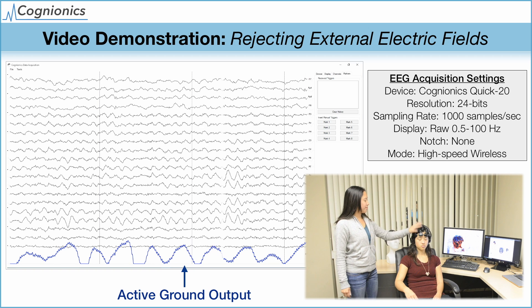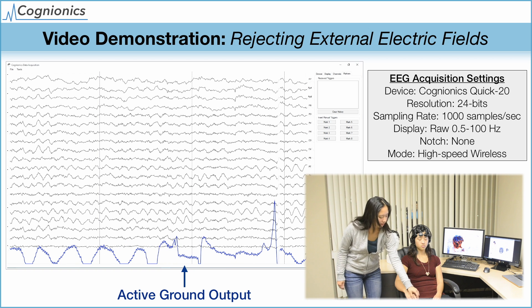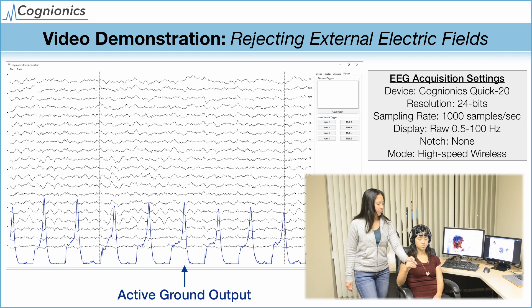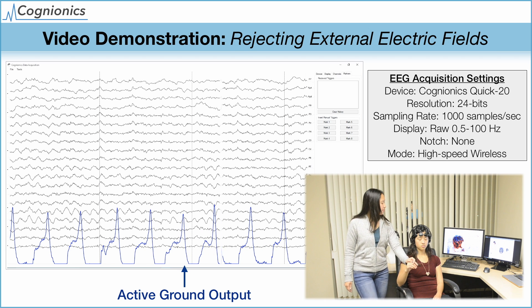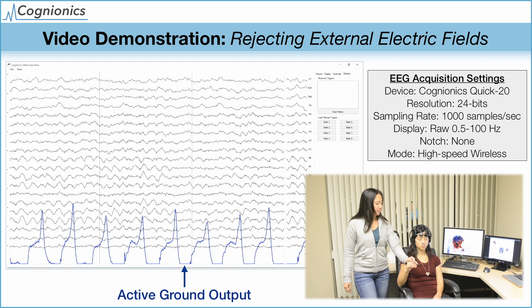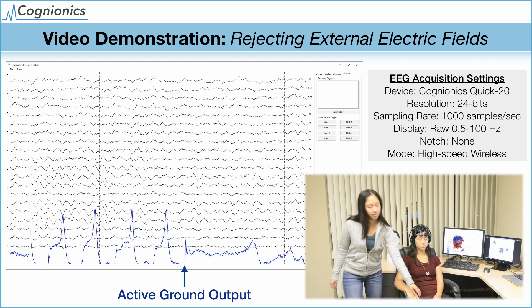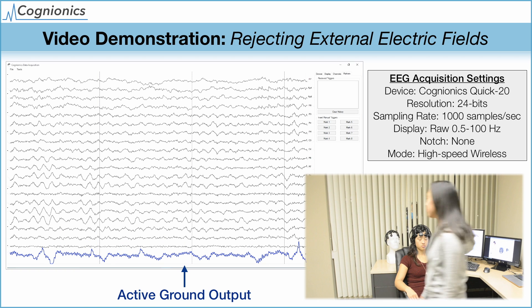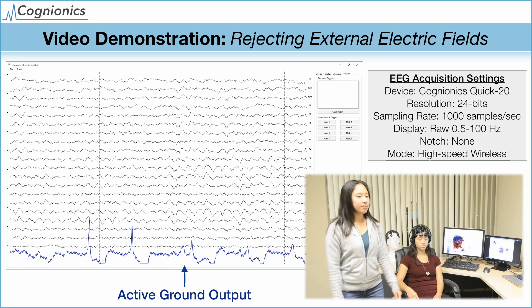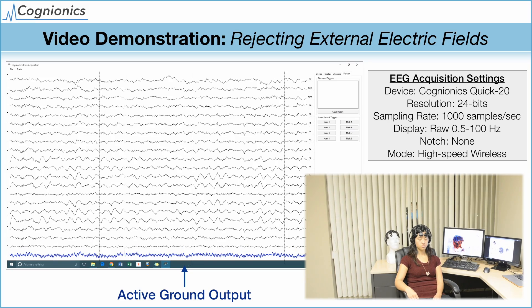We start with our subject with her eyes closed. You can see the clear alpha oscillations in the EEG trace. The blue trace at the bottom is the output of the active ground. As a second person walks in the room, you can see the active ground detecting and cancelling out the induced charge into the subject. Having the second person tap their foot generates a large amplitude electrical artifact to stress the system. Even still, the active ground is able to remove the induced noise, and you can see that the EEG signal remains clean.